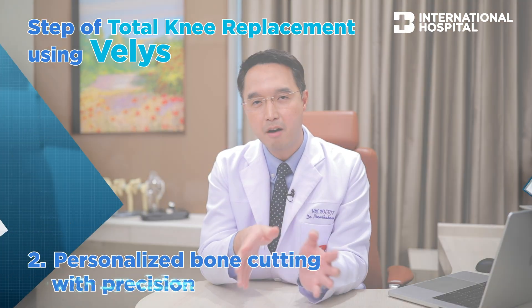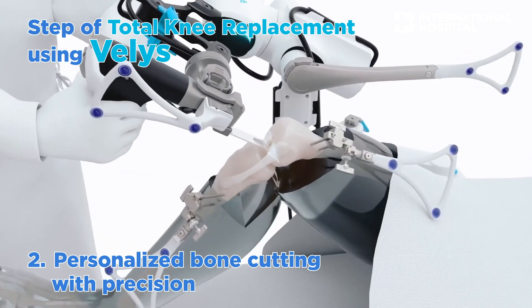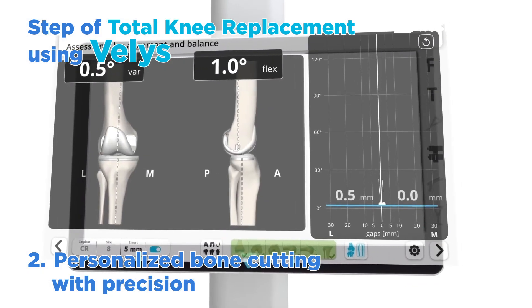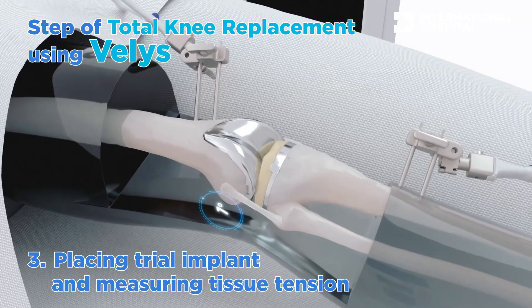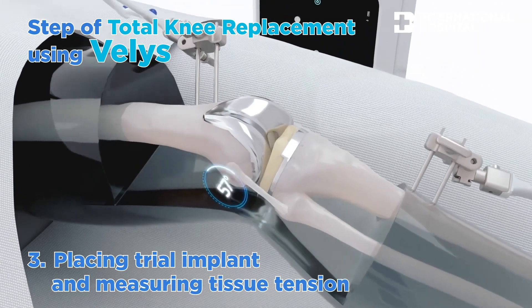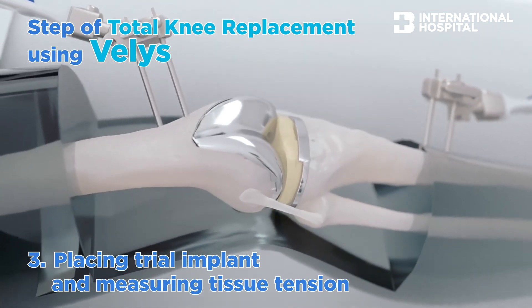After the morphing, we do a bone cut. The robotic system helps guide the surgeon to perform a more precise bone cut. After the bone cut, we put in the trial implant and then measure the tension of the soft tissue. Again, the system helps the surgeon know exactly the proper tension in each patient.